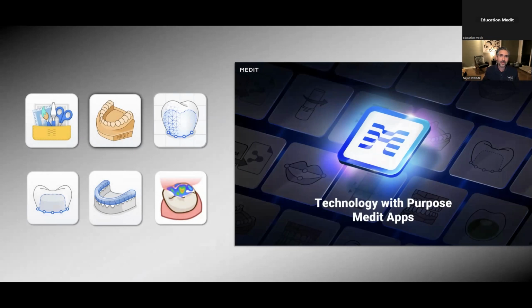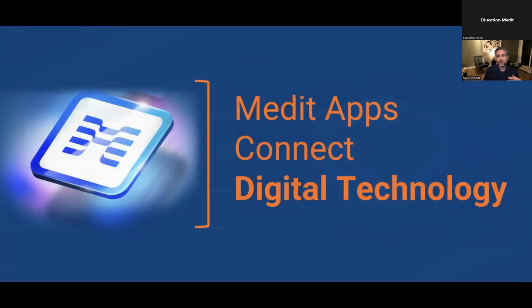And with Medit, all the different apps which are constantly improving, everything from Medit Design to the model builder, the temporary app, and now the clinic beta app and the splints app, give me so much utility that not just myself, but my whole office has become more digitally savvy. We're doing way more things. We even have a position where one of my employees is primarily focused on digital design and doing things with 3D printing. And that's really all thanks to Medit apps because it connected that technology.